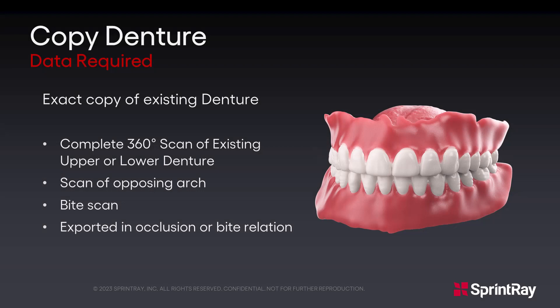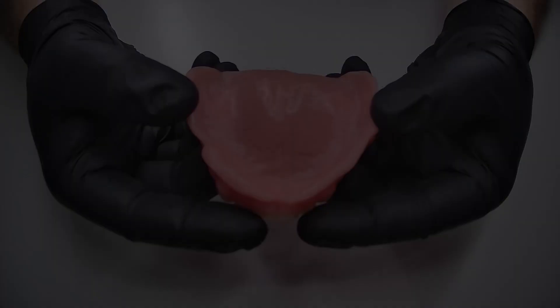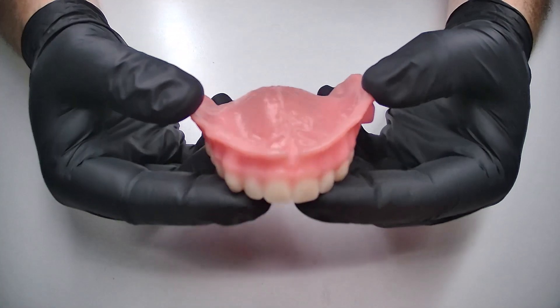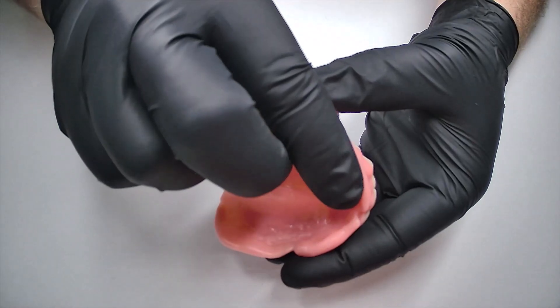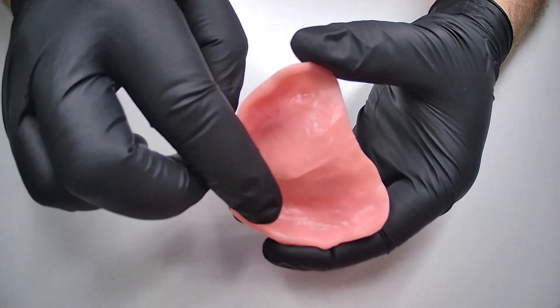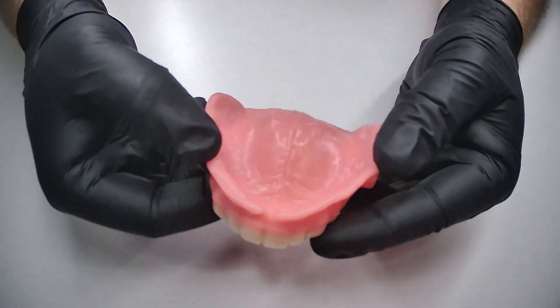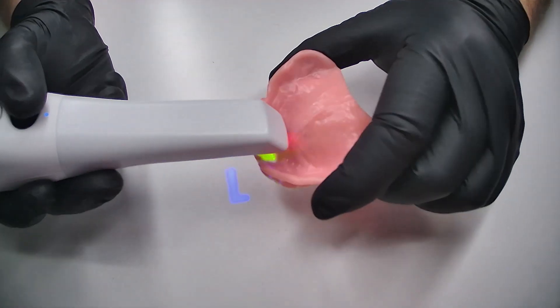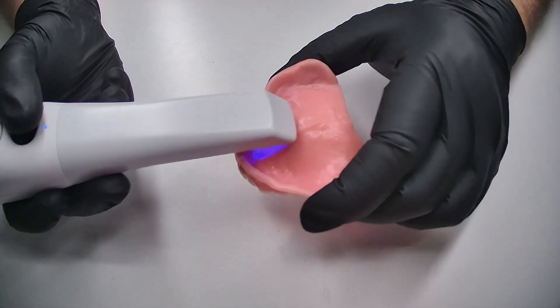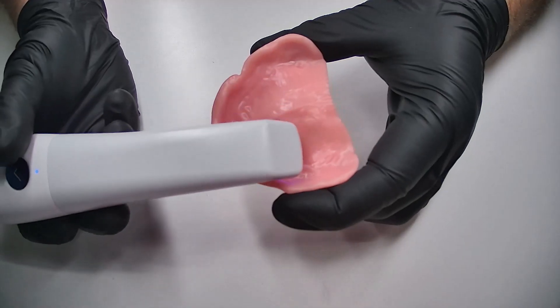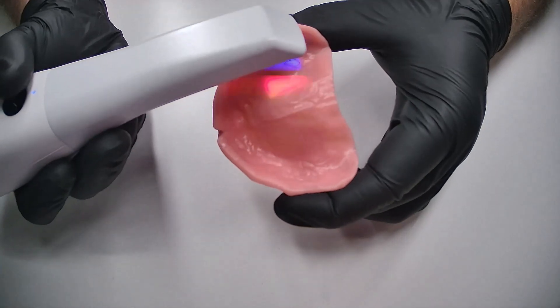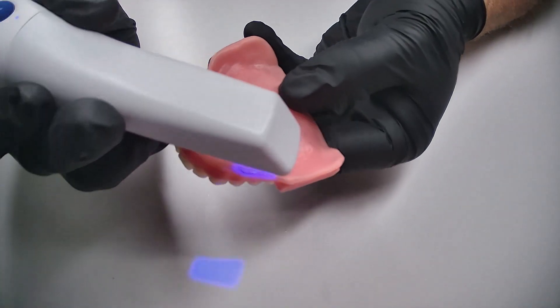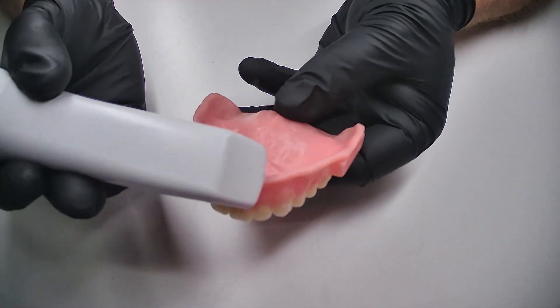For the copy denture workflow, we will be creating an exact copy of the existing denture. We will be taking a complete 360-degree scan of the existing denture, a scan of the opposing arch, as well as a bite scan and exported in bite relation. Begin by reviewing the anatomical features of the denture, ensuring you are aware of any undercuts or anatomical features that may be challenging to scan. In this example, the upper denture will be scanned outside of the patient. Most scanners will have you start with an anatomical landmark such as the incisive papilla. This gives the scanner a reference point to work from and allows the data to be correctly aligned during the scan process. Work slowly to ensure that all data is captured such as undercuts and the occlusion.